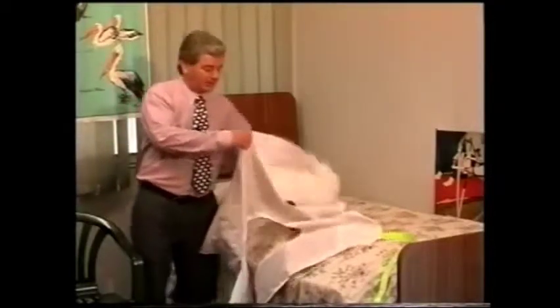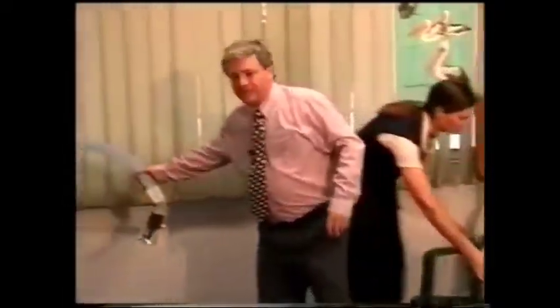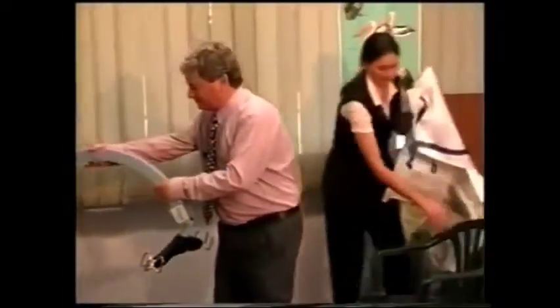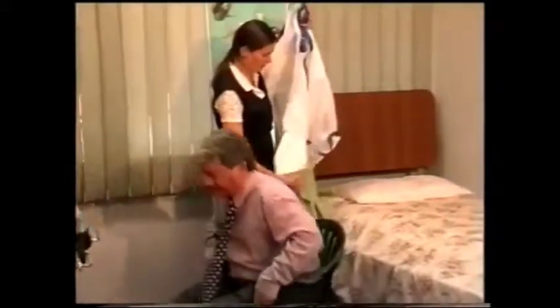Right, now then, I'm going to sit down, we'll bring the hoist over. I'm going to be the guinea pig this time, or the patient. And Vicky's going to assist me by putting the sling on. There we are. You got enough room behind there? Yep. Right.